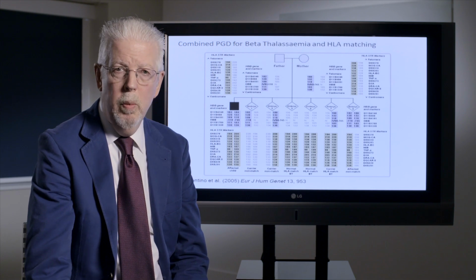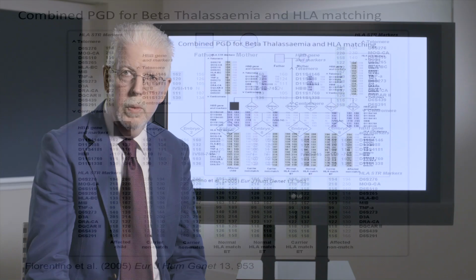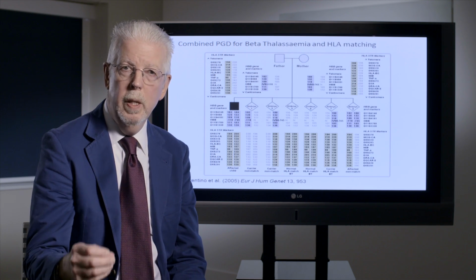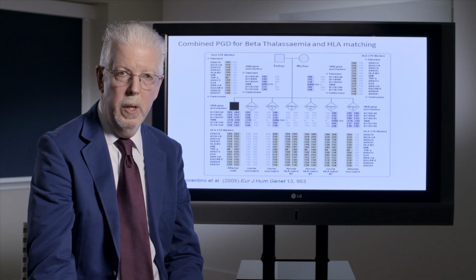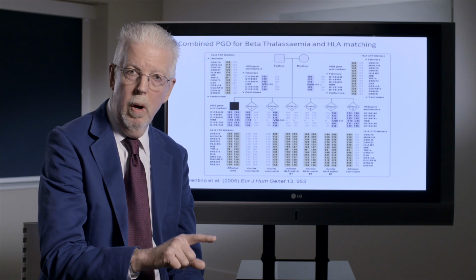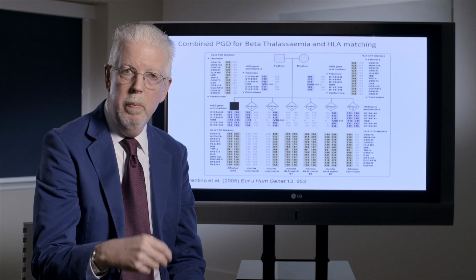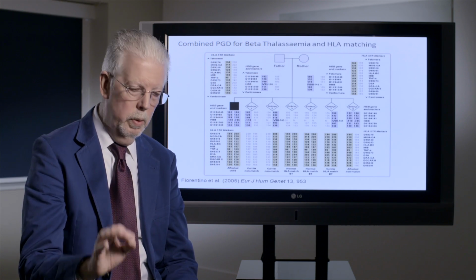This will be familiar to anyone that is involved in PGD. This has been the current practice. So following the whole genome sequencing, it gave us access to these markers. One particularly useful set of markers, short tandem repeat markers, can be used essentially to fingerprint a chromosomal region that carries a gene defect. Now, I don't have time to go into all the details of this, but essentially this allows you to identify both the chromosome with the affected gene and the normal chromosome, and gives you much more accuracy than just simply looking for the single gene defect itself, the actual mutation.